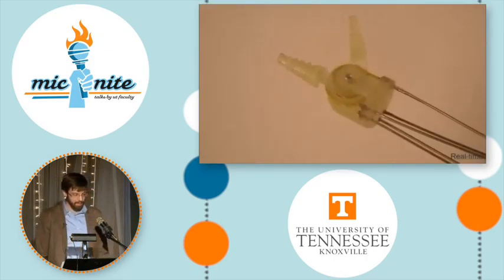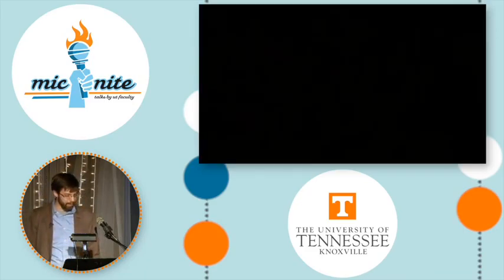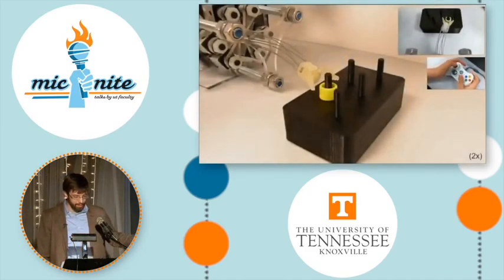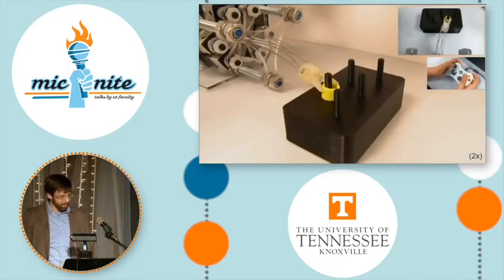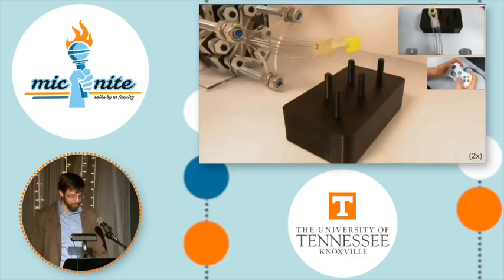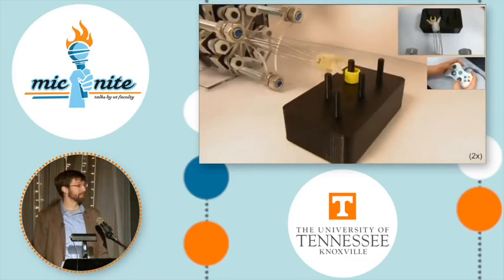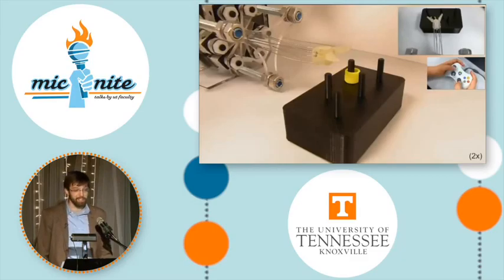The end result is that a user can remotely control this robot using an input device, shown here an Xbox controller. This is a PEG transfer task, which is a standard assessment of dexterity for surgical robots. If all goes well, this parallel robot could be coming soon to an operating room near you, though I sincerely hope that you won't need it. Thank you.